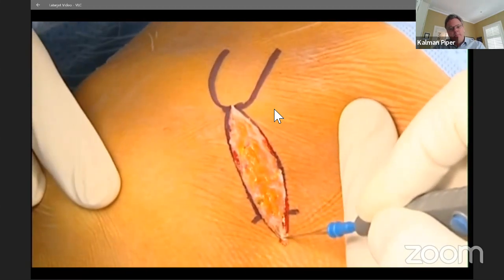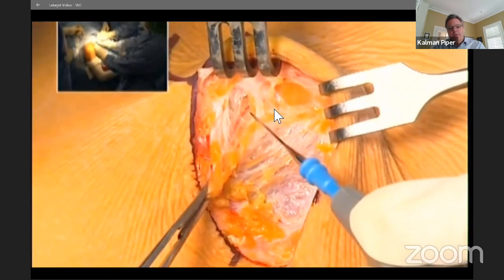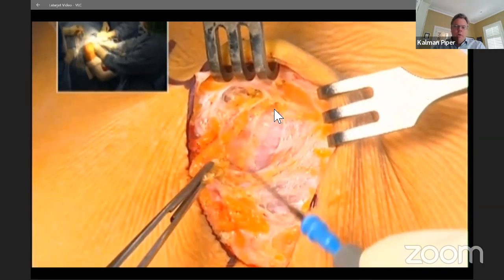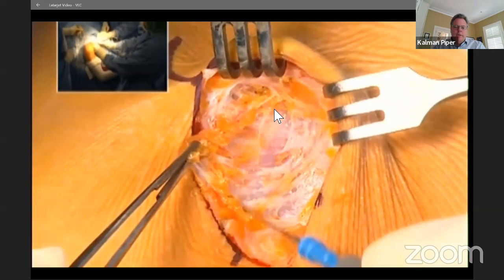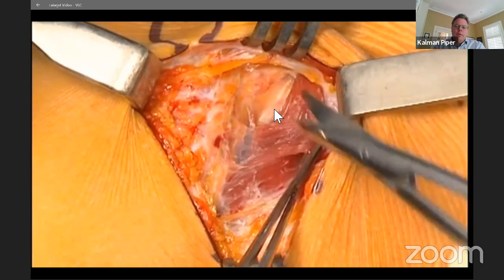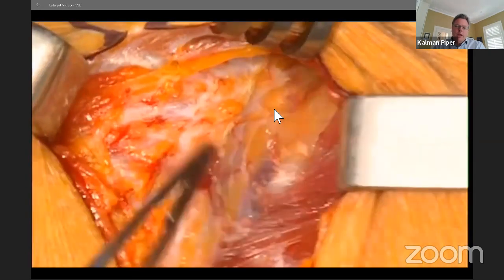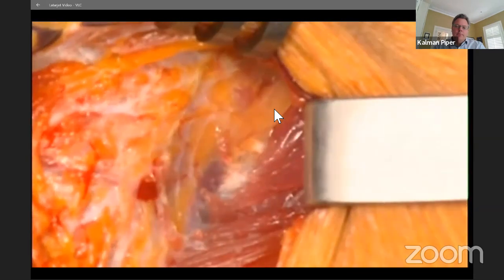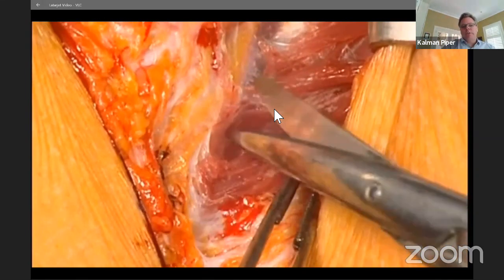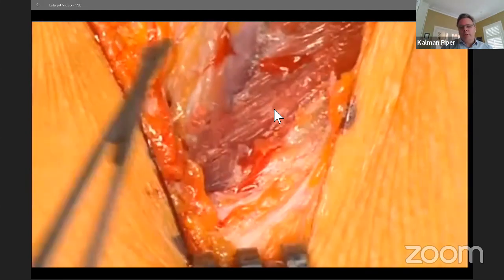Deltopectoral incision, using the fat to identify the plane between the pec major and the deltoid muscle. Once I've established that plane and got down to the clavipectoral fascia, I place my finger in the wound and feel for the tip of the coracoid process. And the first retractor to go in is a retractor behind the coracoid process to lever up and expose the superior surface of the coracoid. We'll place that in a moment.